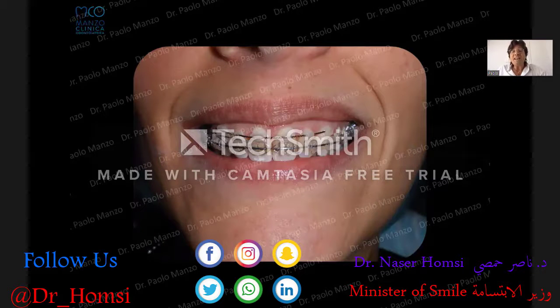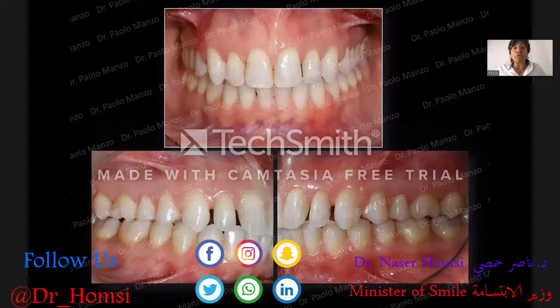And remember, anytime you prepare a patient for the interdisciplinary second step, restoration or prosthetic step, you have to stop the position of the teeth. Even if you need a couple of days or 3 days, 5 days to prepare a removable appliance like a vacuum formed one to deliver to the patient, you should stop the patient with a retainer. Something very easy, like in this case, I placed a retainer from canine to canine, and now I feel comfortable to remove the brackets, and I can wait very comfortably for the upper appliance if I want to use a removable appliance. Then this is the end of the orthodontic phase.